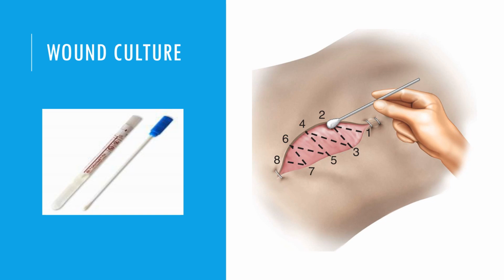If there is a presence of bacteria, you can collect the bacteria on the tip of the applicator. And if the patient has multiple wounds, please use a separate swab for each wound and label it. Labeling is a must. If you send a swab to a lab and did not label it, you have to redo the whole procedure.